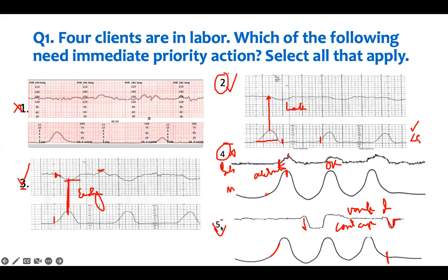So we see this patient, we see this patient. We may have to, head compression, like I said, it's not that bad, but we may have to do something about this one. So those are the 3 you need to see. Of course, you have to know your chop. Okay, I know everybody knows about it. So variable deceleration is due to cord compression. Early deceleration is due to head compression.